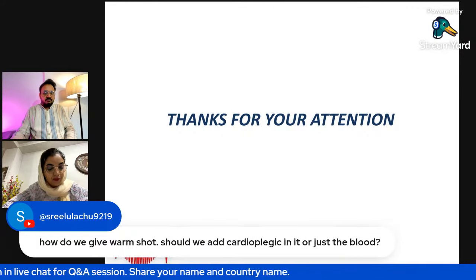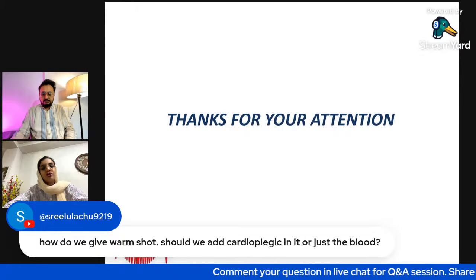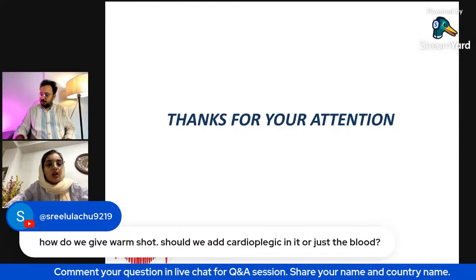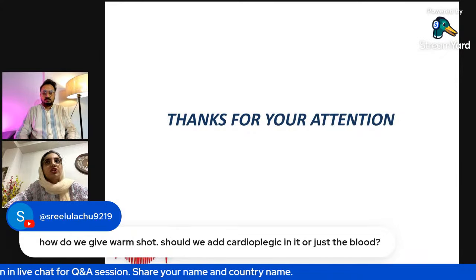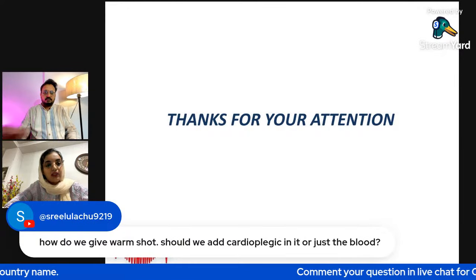How do we give a warm hot shot? Should we add cardioplegia to it or just blood? Actually, it depends on many factors. If I want to talk about it completely, we inject the hot shot at 37 degrees, usually antegrade, at a pressure of 60 to 80.